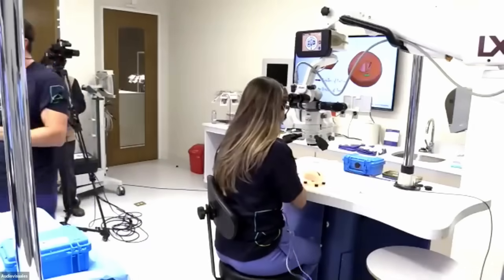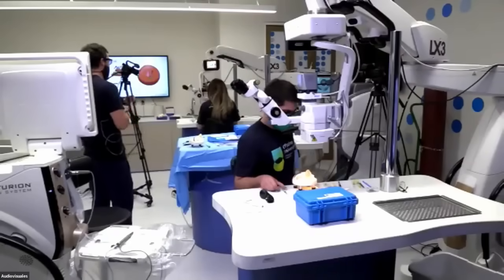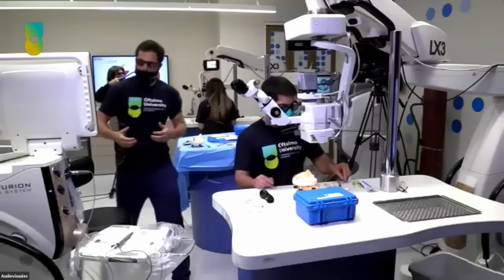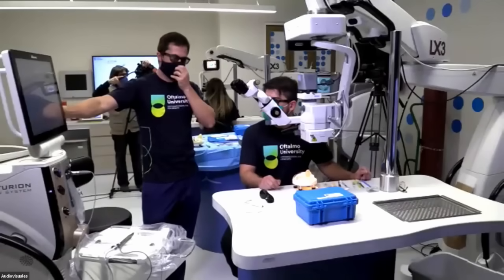I think we learned a lot from Capsulorhexis. We understood that you can learn so much in models like this, but in phacoemulsification, this is where the magic really happens. Why? Because we're going to have a machine, and we're going to have to listen to the machine. This is going to be so important.